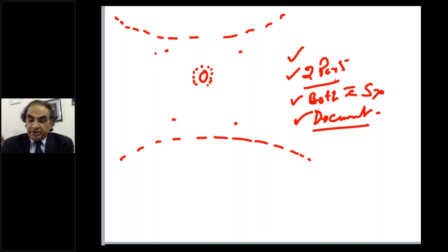Right? And then something very, very important. I hope you're paying attention as I speak. Now, you should not take a biopsy as soon as you see a lesion. Why? The pneumoperitoneum has been created, which is kept at a particular pressure. I'll come back to this biopsy point later on. And you will remember that it's important.